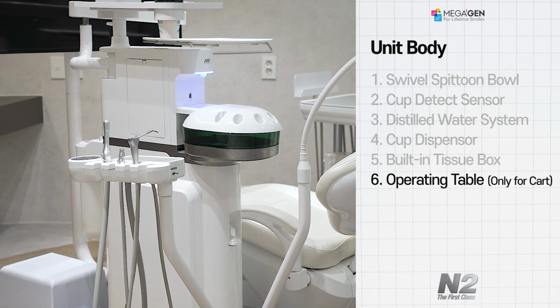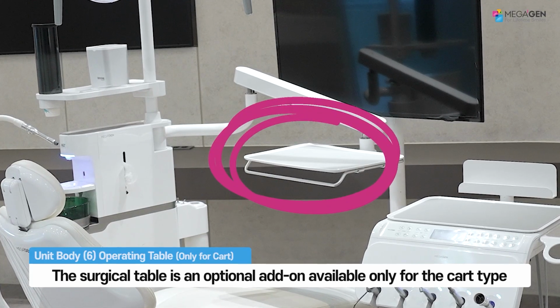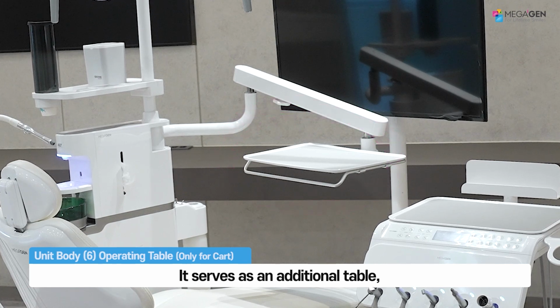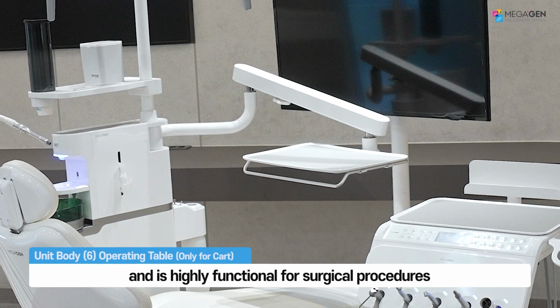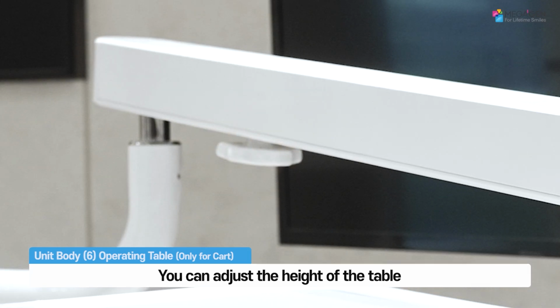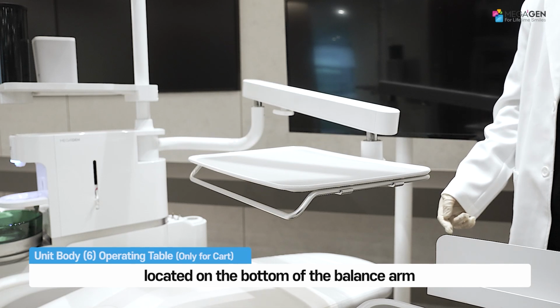How to use the surgical table. The surgical table is an optional add-on available only for the cart type. It serves as an additional table, complementing the doctor's table, and is highly functional for surgical procedures. You can adjust the height of the table by loosening or tightening the knob located on the bottom of the balance arm.